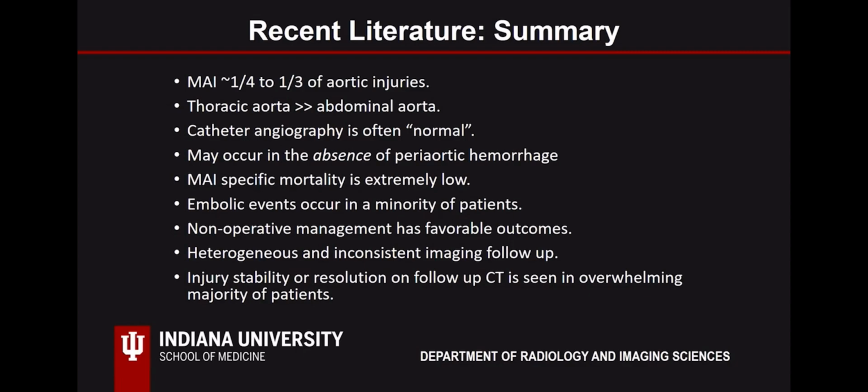There's no universally accepted follow-up imaging algorithm for patients with minimal aortic injuries. However, a vast majority of these patients will see stability or resolution on follow-up.